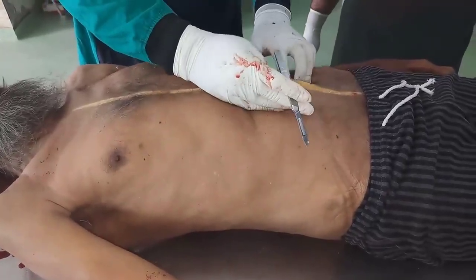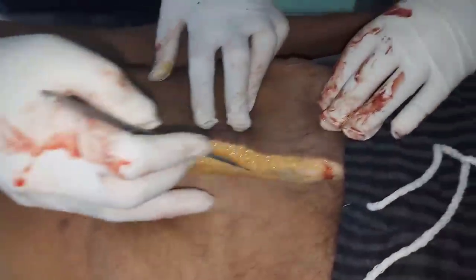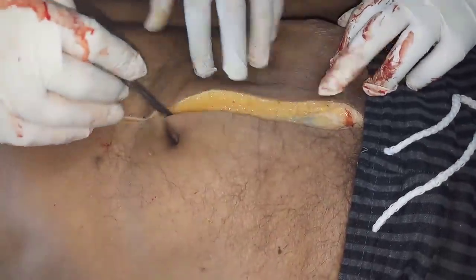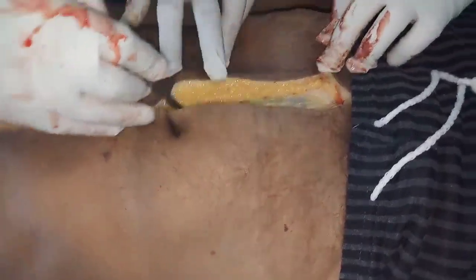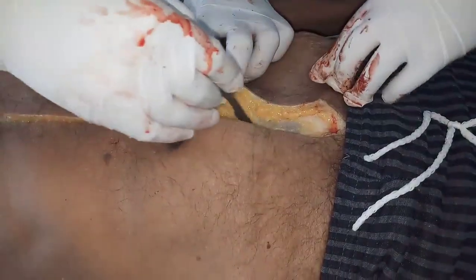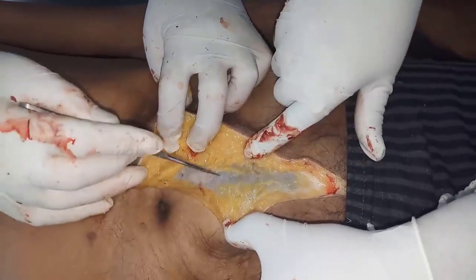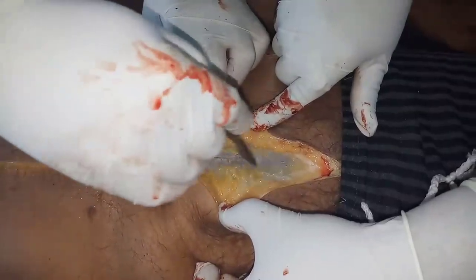You can see the layers of the abdomen. Superficial fatty layer. This is a fat layer. I'm going to cut it. The rectus sheath. In the rectus sheath there are rectus muscles. I'm going to cut all these structures. See, this is the rectus sheath, below this fat. If we cut this rectus sheath, you will see the muscles.